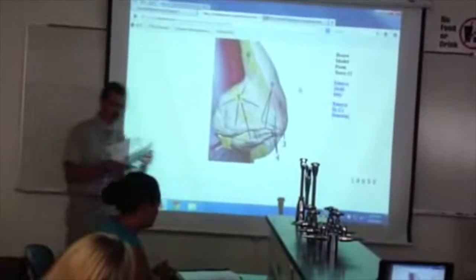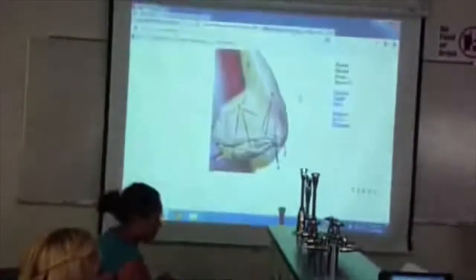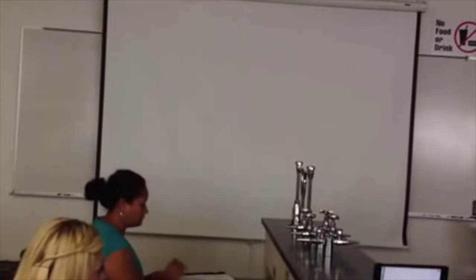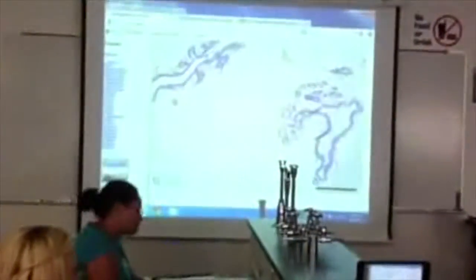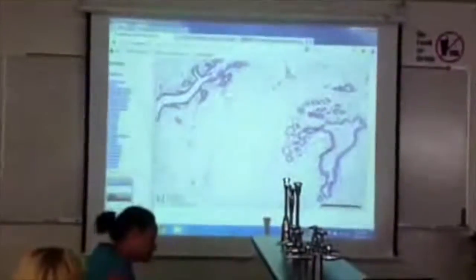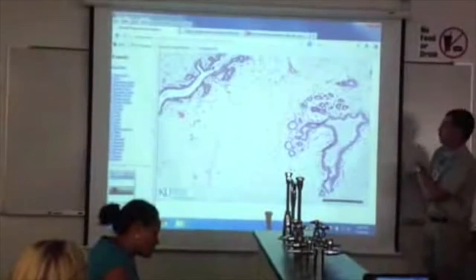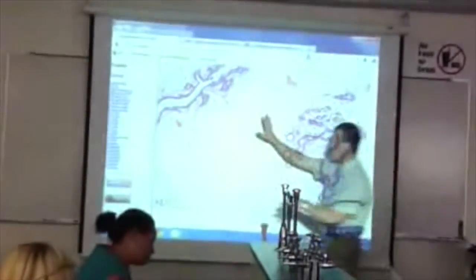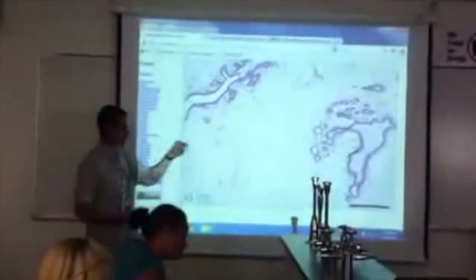So that's the reality. So today we're supposed to look at a slide of this. All right, let's do mammary gland slide. Depending on the slide you have, there's some variability here, so don't overanalyze. But this is breast tissue, mammary gland, whatever you want to call it. And these circles represent the actual glands or alveoli making the milk. So everything you see is background and just connective tissue or fat. The milk is actually these things.